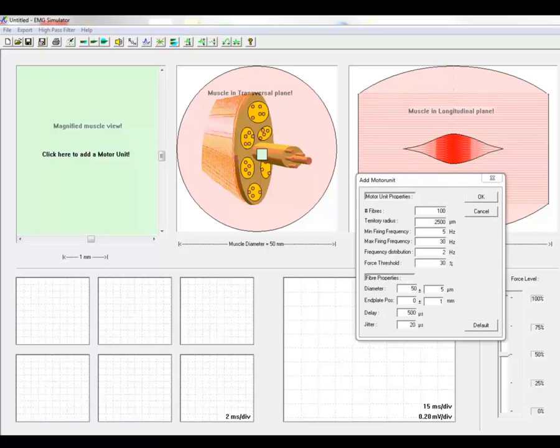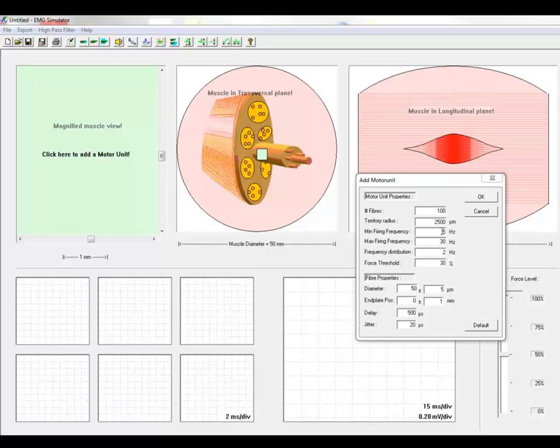The properties of a motor unit and its fibers can be optionally changed. Parameters such as number of muscle fibers, territory over which they are distributed, the firing rate, the firing threshold, muscle fiber diameter and its variability, and the jitter.